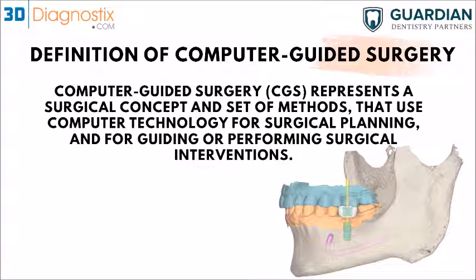So with that being said, the definition of computer-guided surgery: basically it represents a surgical concept and set of methods that use computer-guided technology to try to implement what we know as dentists in this treatment planning software that we use, and finally just end up with something that would help us and guide us in performing that surgical intervention.